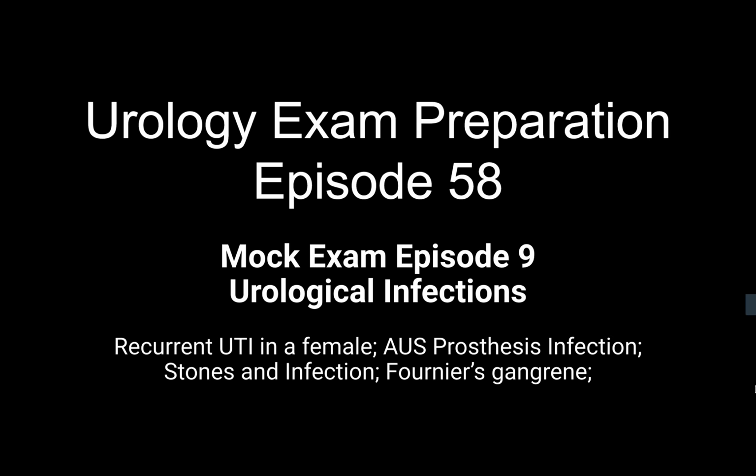So what is your protocol when you have to remove the prosthesis due to infection? How are you going to prepare it? I would explain to the patient what has happened and then take him to theater under general anesthesia. I'll go through the same incision and remove the implant.